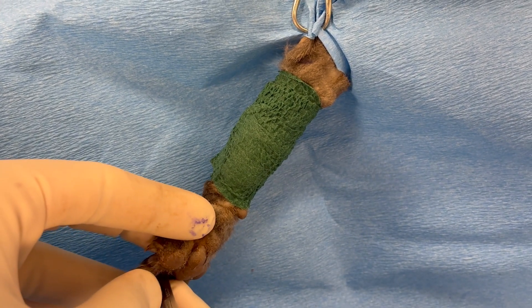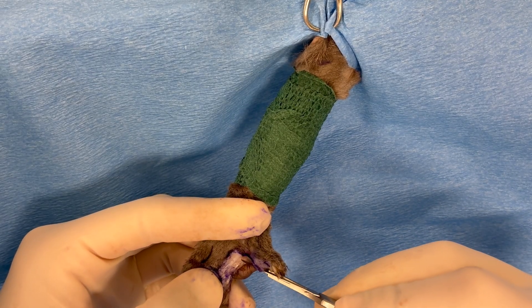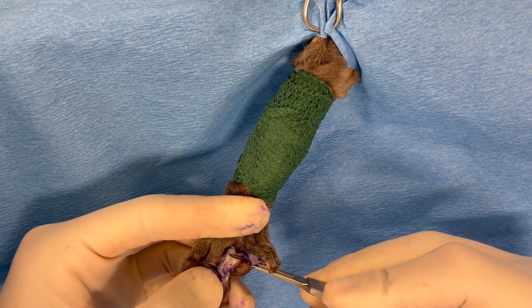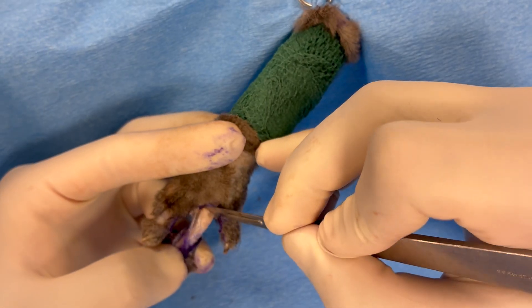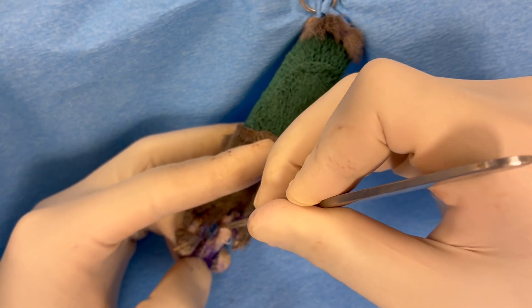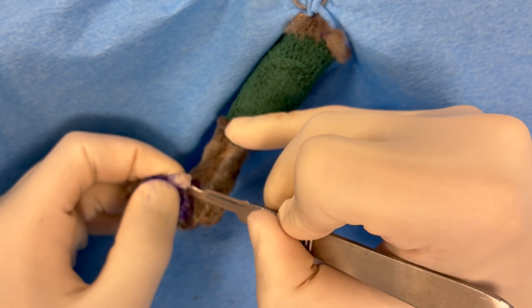Much of this dissection is also performed with electrocautery. Now we're going to transect the extensor tendon, and the flexor tendon will also need to be sharply transected. The metacarpophalangeal joint is identified and then sharply dissected either with electrocautery or a scalpel blade, as depicted here.